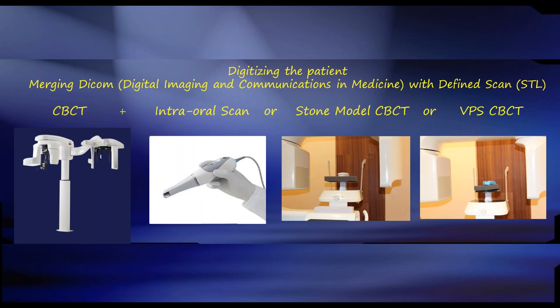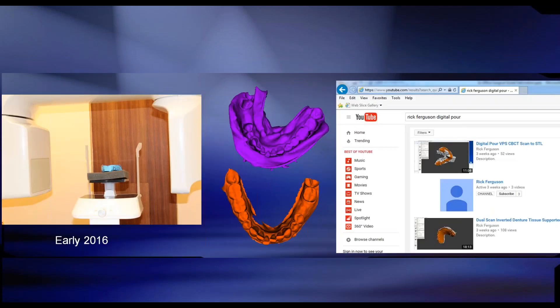So the idea is to digitize the patient — merge the DICOM images with the defined scan or STL file, either from CBCT plus an intraoral scan, CBCT plus a stone model scan on the CBCT, or a VPS vinyl polysiloxane impression scanned in the CBCT. I pioneered a technique in 2016 to take a CBCT image and reverse it from a DICOM of an impression — you can find a video on YouTube. The thing about having the CS8100 is it will do this automatically for you, with the fewest number of clicks and very high-quality output.